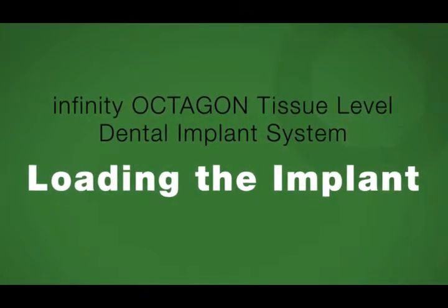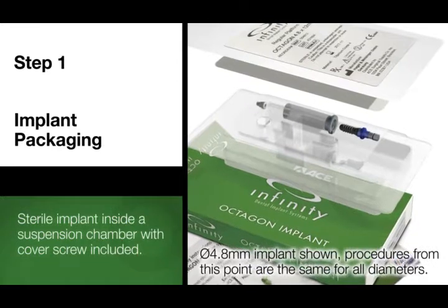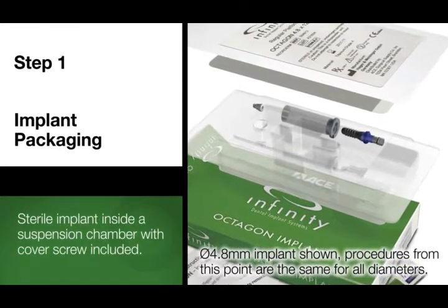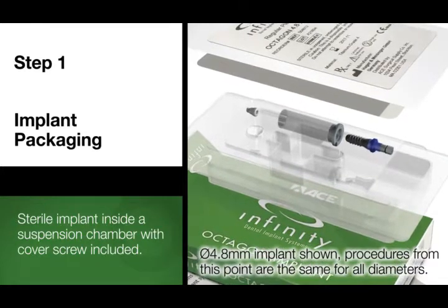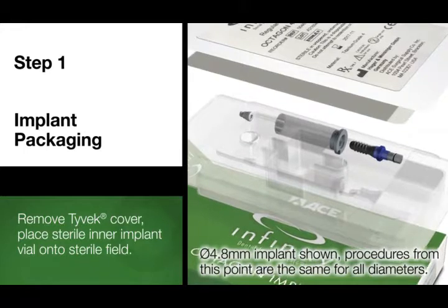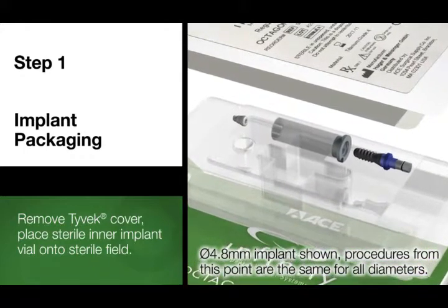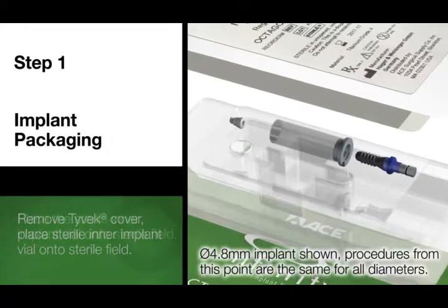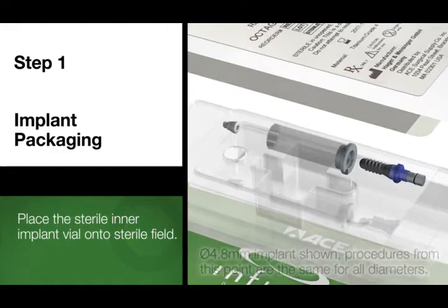Loading Infinity OCTAGON tissue-level dental implants. Step 1. The implant package you have received contains a sterile implant with an implant suspension chamber and a cover screw stored separately just below. Remove the implant blister package from the box. Open the blister package over a sterile field by locating and pulling off the sealed Tyvek lid. With the blister package open, drop the implant vial onto the sterile field.